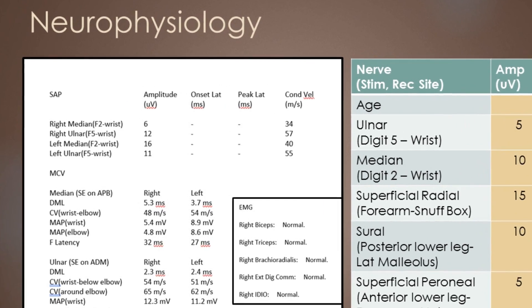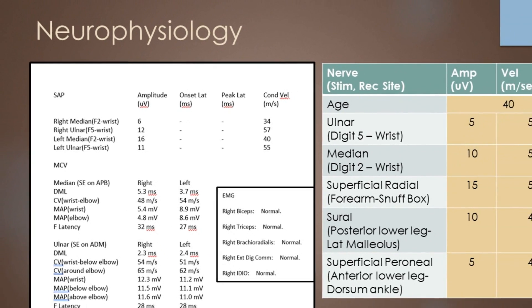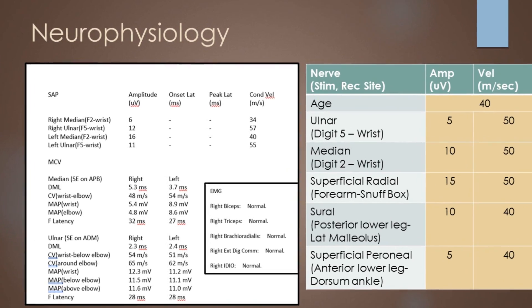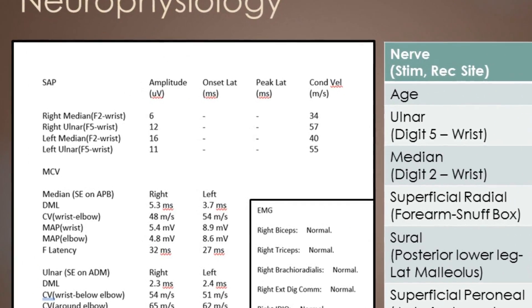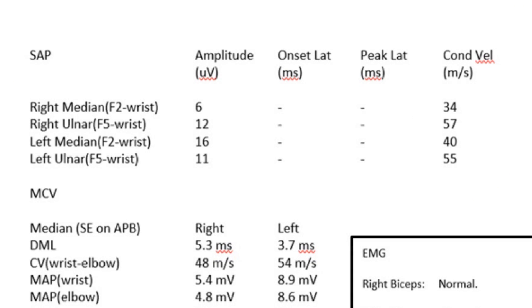Let's first have a look at the sensory responses. We can see over here that the amplitude is 6 microvolts and the velocity is 34 metres per second — so the amplitude is both reduced and the velocity is slow. We would have expected it to have been 10 microvolts and 50 metres per second, so it's both small and slow.